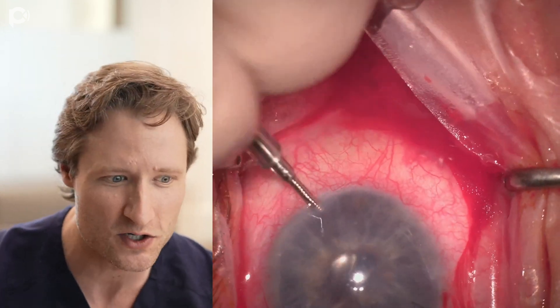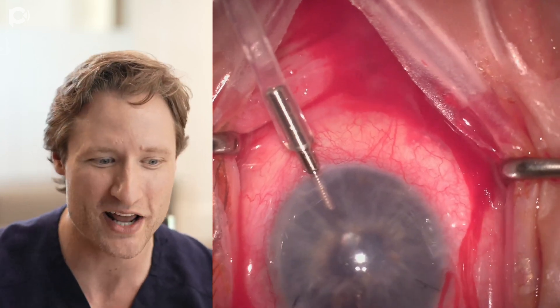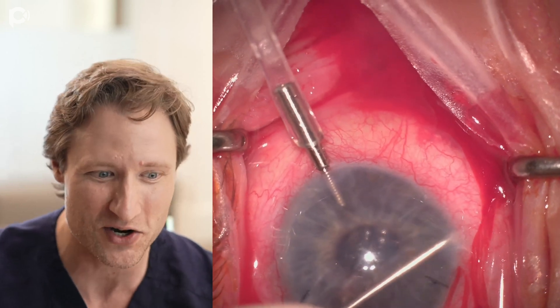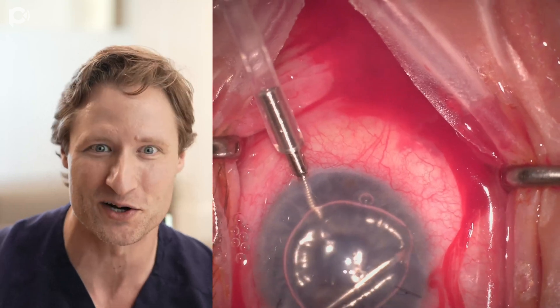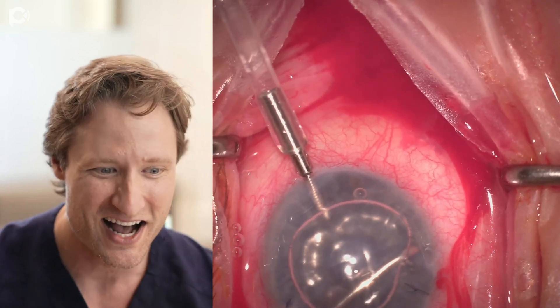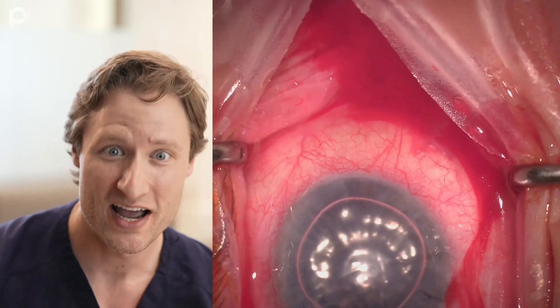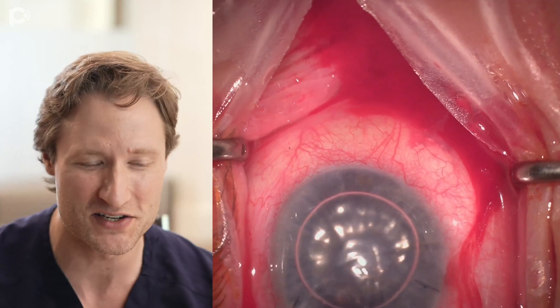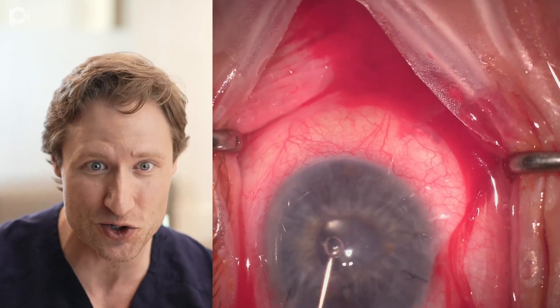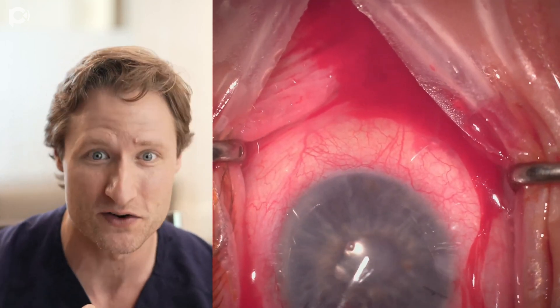I'm going to make my iridotomy using the Ertl cystotome handpiece. Watch what happens when I go into the eye — here I am making a little iridotomy inferiorly. Look at all that air that comes up from behind the iris, from behind the pupil, behind the lens, way out peripherally. This air is coming from absent zonules. There is often a diffuse zonulopathy — it's not just a few little strands in the vicinity of the tube shunt, it's all over the place. If the tube damages the endothelium, it is at least as bad for the zonules.